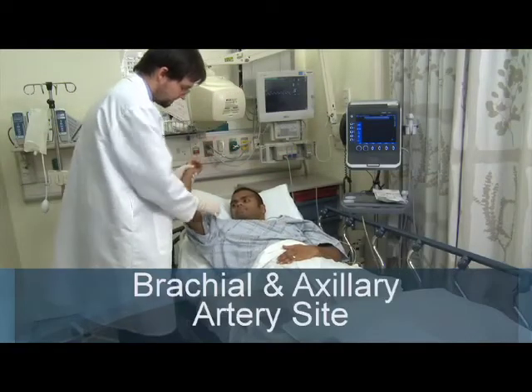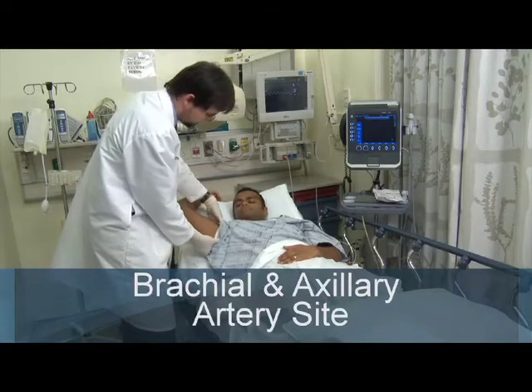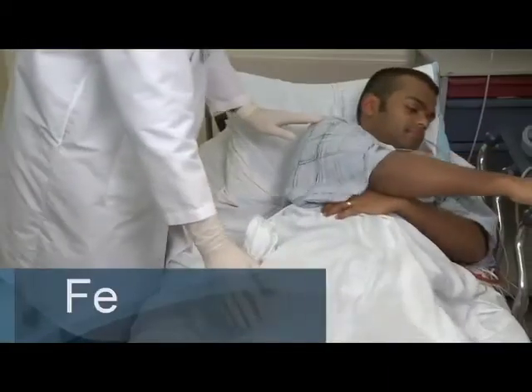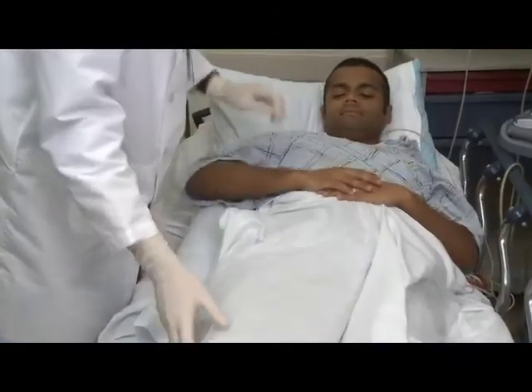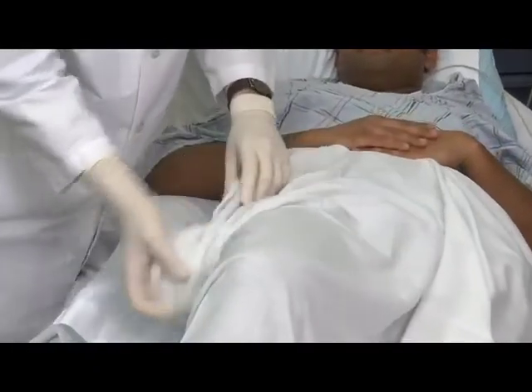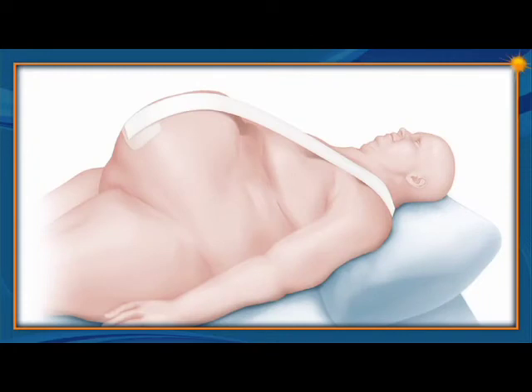For the brachial and axillary artery sites, abduct and flex the arm at around 90 degrees. For the femoral artery site, place a pillow under the ipsilateral hip. This will provide a slight extension of the hip to optimally expose the inguinal area. In obese patients, the abdominal pannus may need to be held or taped out of the way.